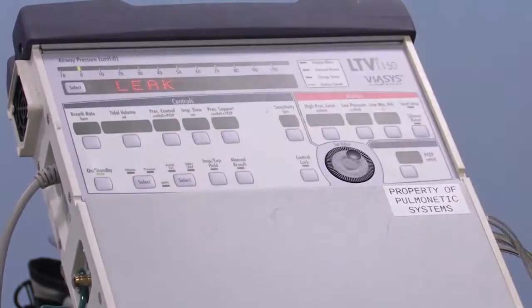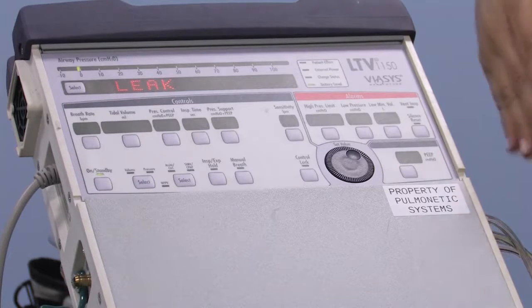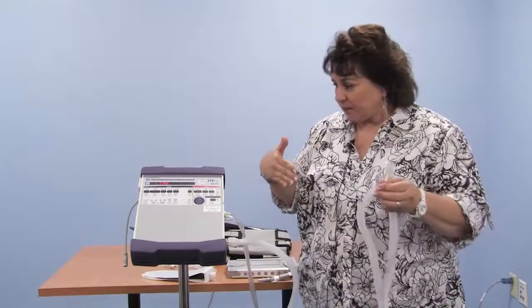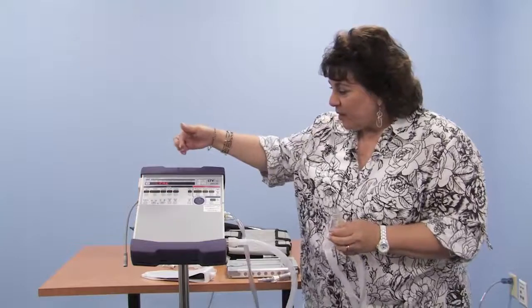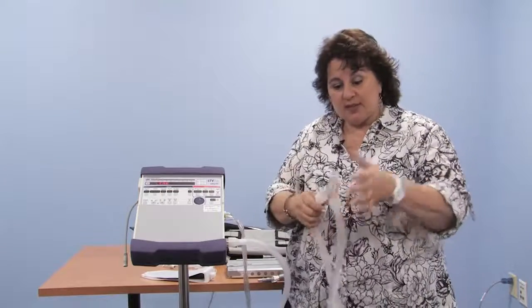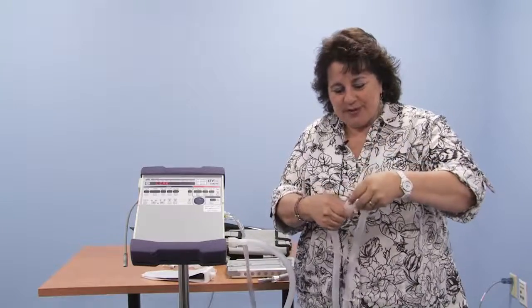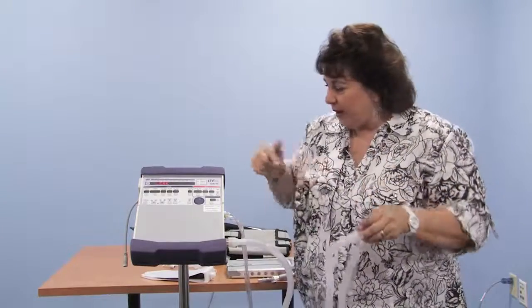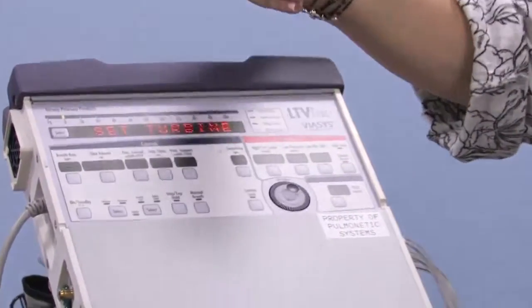You want to know that you set it up properly and there's no leakage of air out of the circuitry. For obvious reasons, without the humidification system, there are very few connectors, so the chances of a leak are much lower. But you want to assure that the exhalation valve is working properly as well. So what the manual will tell you is to now cover the patient Y with a glove, which would be important for infection control reasons. Cover the hole that you do have, hit the button one more time, and now we're in the leak test.